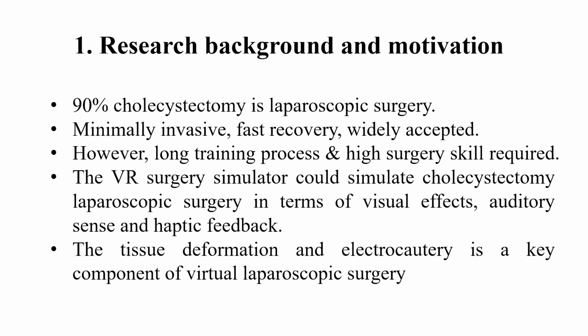In recent years, virtual reality, VR, based training has greatly changed surgeons' learning mode. It can simulate the surgery from the visual, auditory, and tactile aspects. VR medical simulator can greatly reduce the risk of the real patient and the cost of hospitals. Laparoscopic cholecystectomy is one of the typical representatives in minimal invasive surgery, MIS.